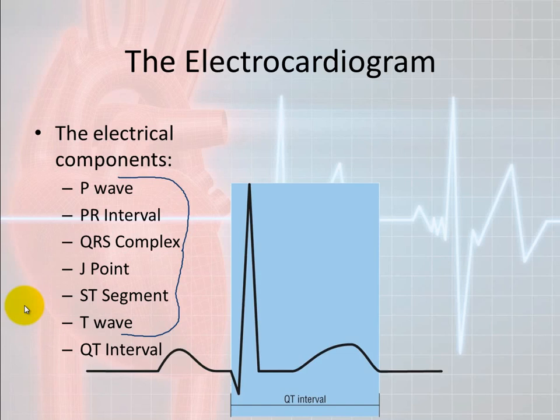So I'm going to go ahead and discuss the intervals now so that when we discuss them later, they won't be quite so foreign. I will review these again later, but it's a nice little exposure. The first interval I want to discuss is called the QT interval. This is a very common interval that is utilized throughout higher levels of healthcare.